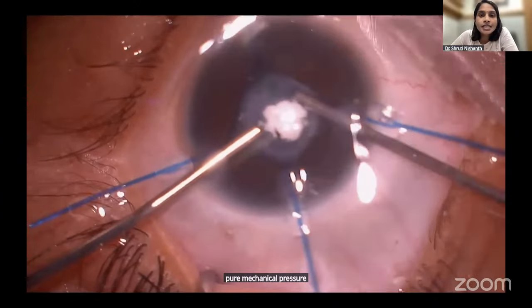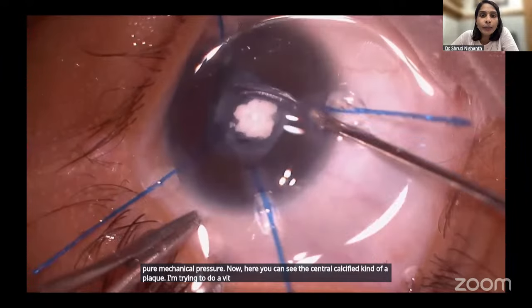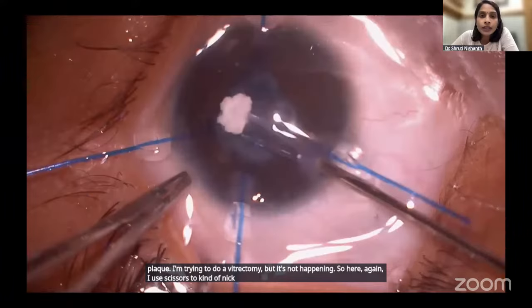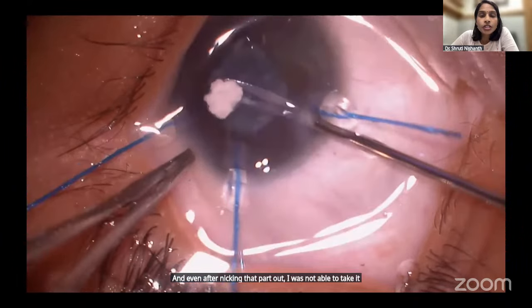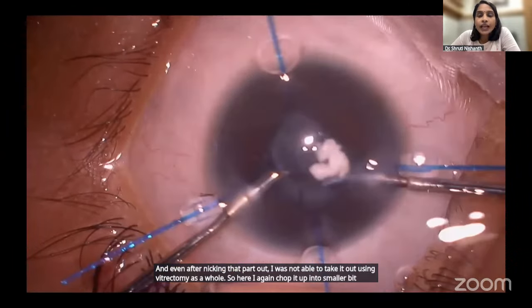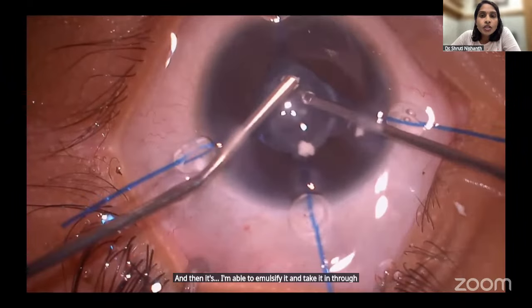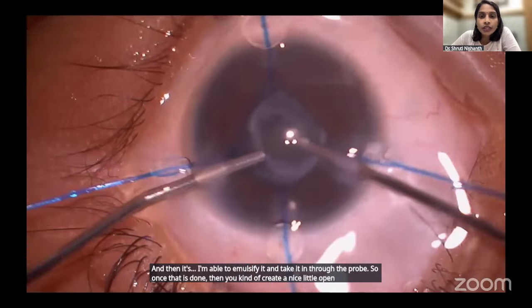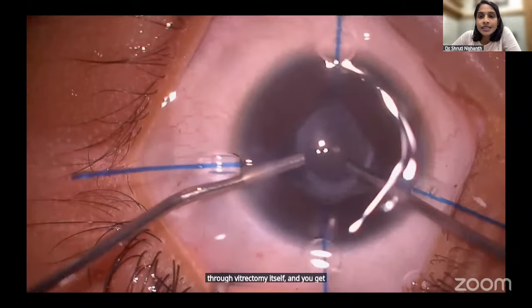Now here you can see the central calcified plaque. I'm trying to do a vitrectomy, but it's not happening. So here again, I use scissors to nick that part out. And even after nicking that part out, I was not able to take it out using vitrectomy as a whole. So here I again chop it up into smaller bits, and then I'm able to emulsify it and take it in through the probe. So once that is done, you create a nice little opening through vitrectomy itself, and you get this visual axis that can be opened up.